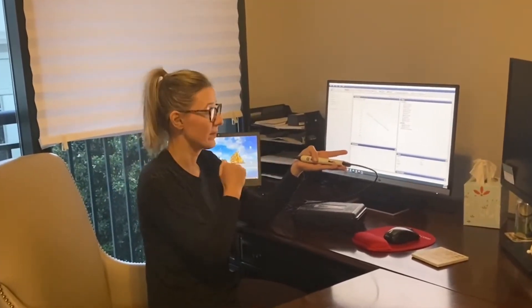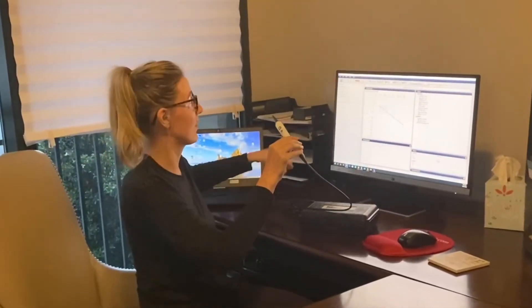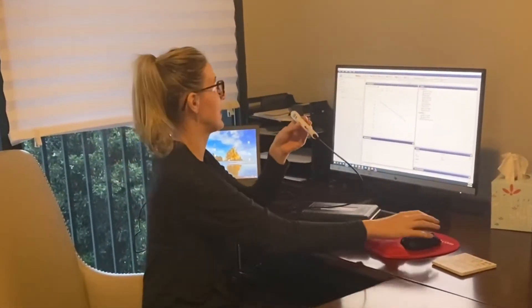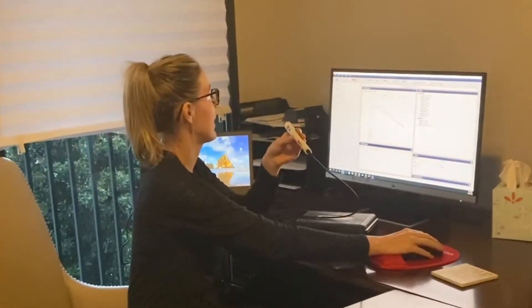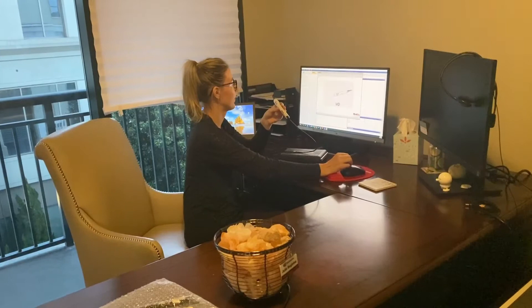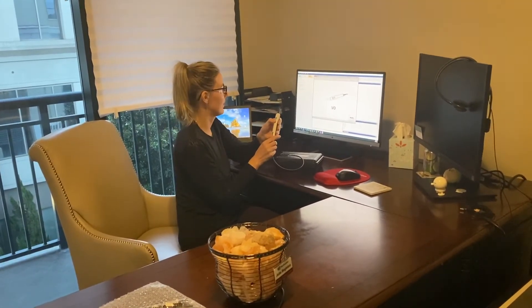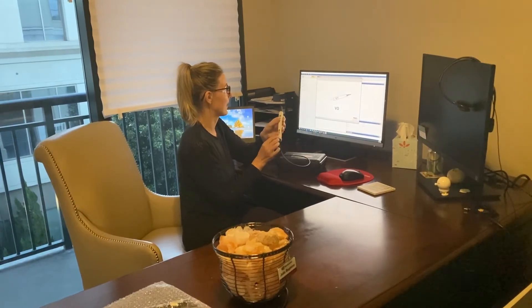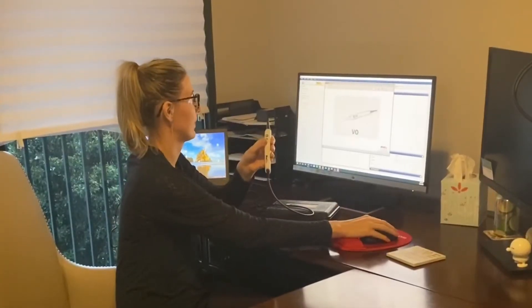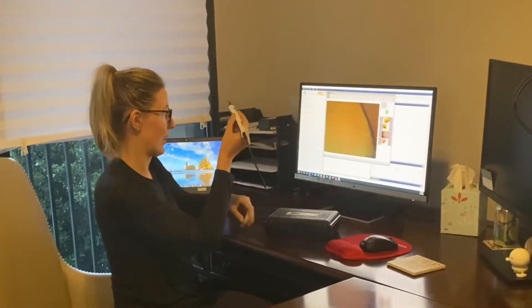We've got it all plugged in — it plugs in with a USB directly into your PC. We're going to go ahead and launch the Medrex Studio software. We're going to hit the power button, the light's going to come on, and I'm going to go ahead and put it into my ear.